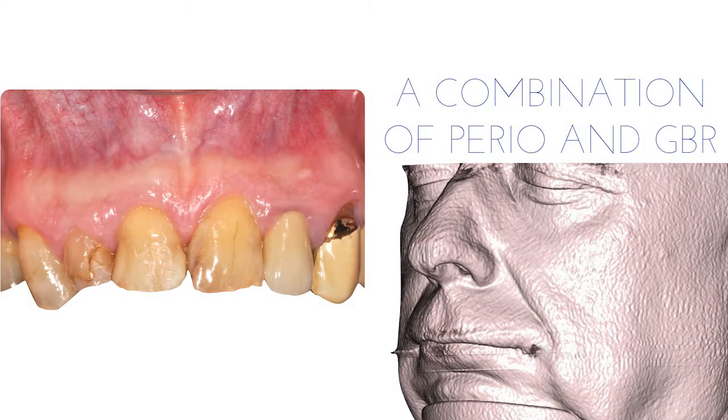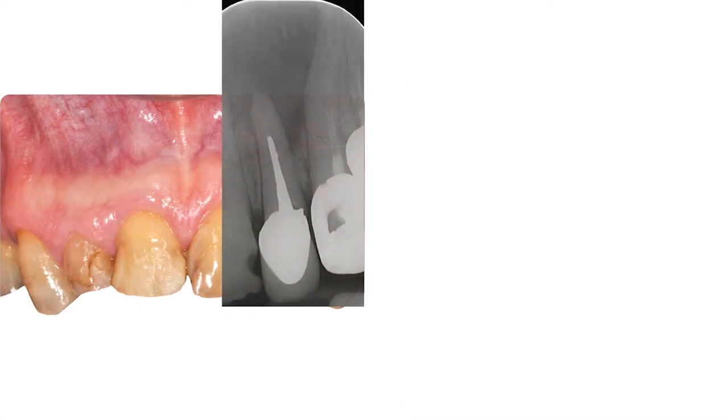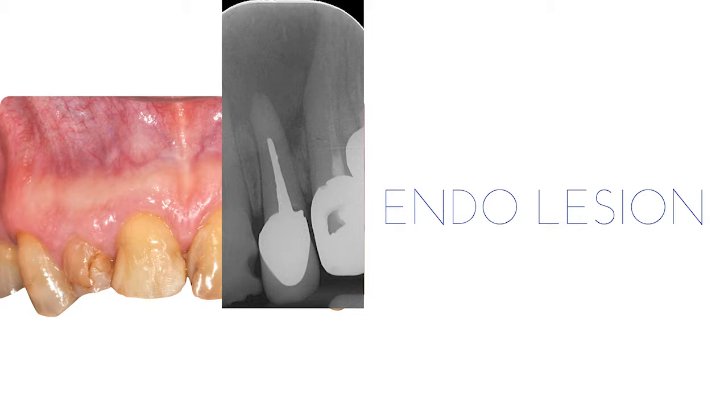Let's move on. Let's face another case where I have a combination of advanced periodontal disease on the first quadrant, and then I have to extract the teeth on the left quadrant because there is a long bridge connected with the wisdom tooth. This is not everything. We cannot just extract all the teeth because it would be easier. There is a huge, pretty large endodontic cyst due to, again, endodontic failures. The majority of these cases are based on failures, based on mistakes, and we can learn a lot from this.